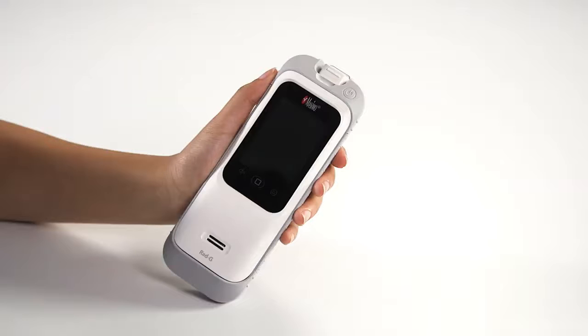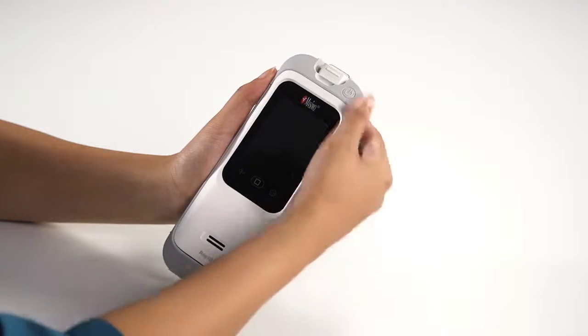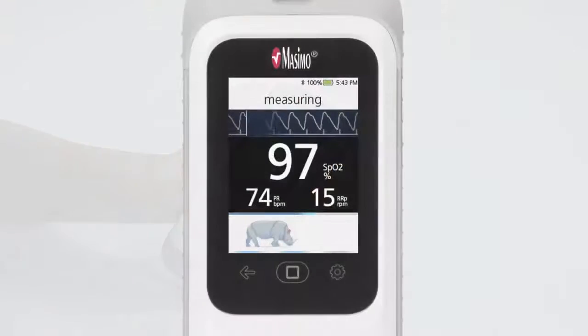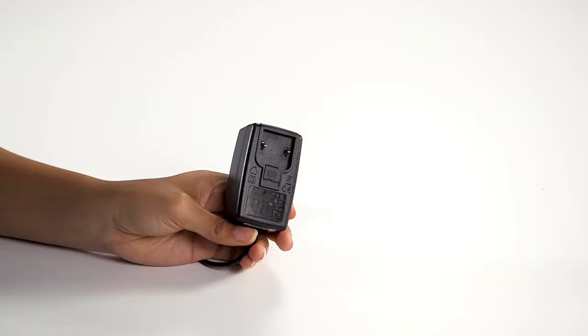Power on the RadG device by pressing the on/off button. Ensure that the RadG is fully charged. To charge RadG, use the power cord and plug assembly insert included in the box.